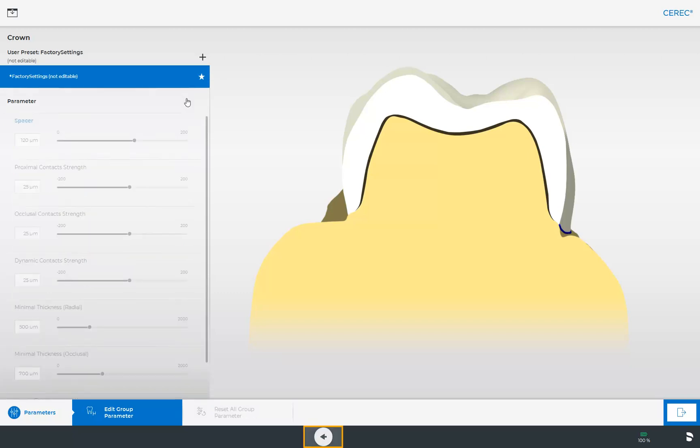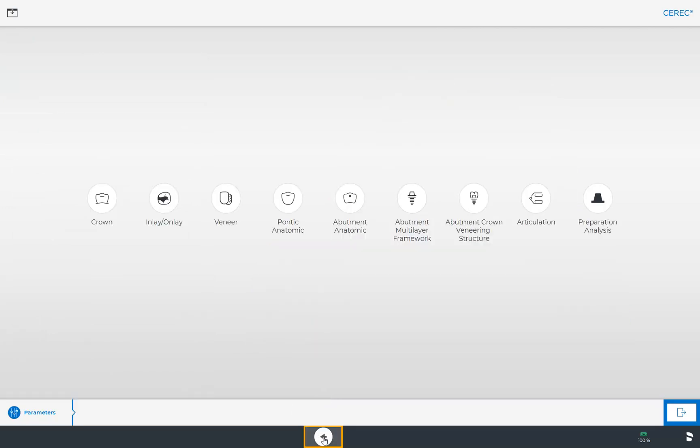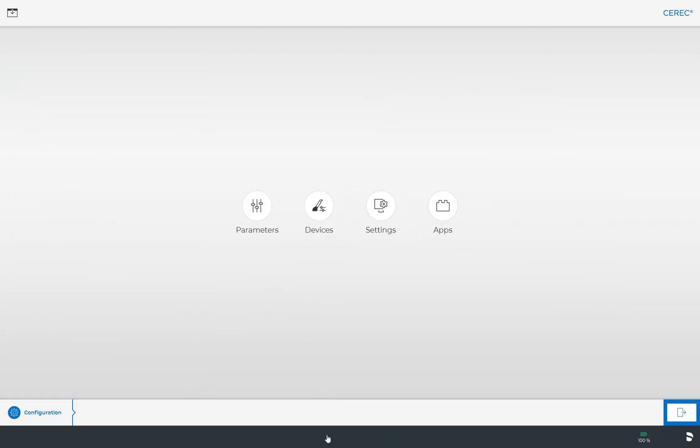At this point we leave the parameter profile for crown restorations and go back one more step so that we can select the next submenu, Devices.